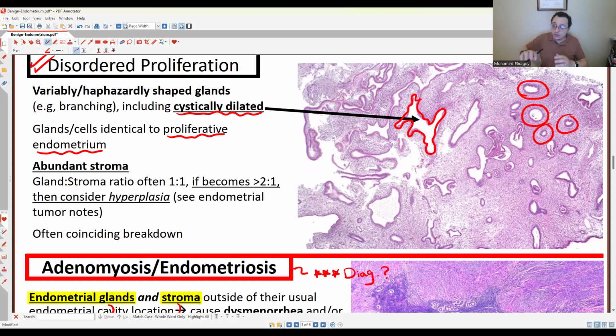So it's as if you're having a kind of hormonal problem. This endometrium is not properly responding to a proper hormonal pattern. It looks like there is estrogen, and some progesterone might come and take place, but the estrogen is driving the whole thing to the point that you see some endometrial glands which look very proliferative, and some other glands that try to become secretory, but their lining still looks proliferative. That's when we say disordered proliferative endometrium.